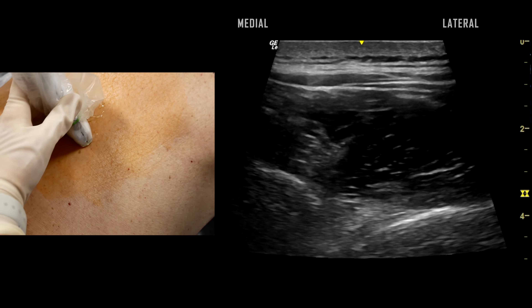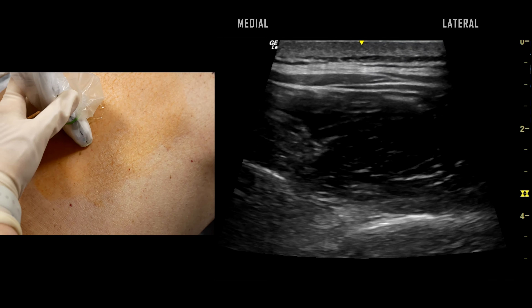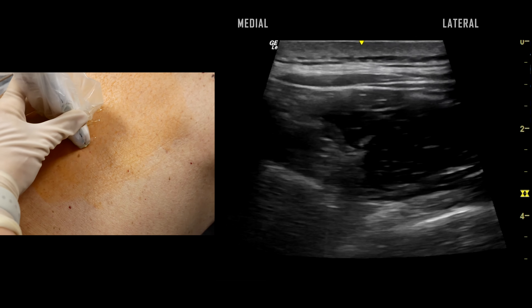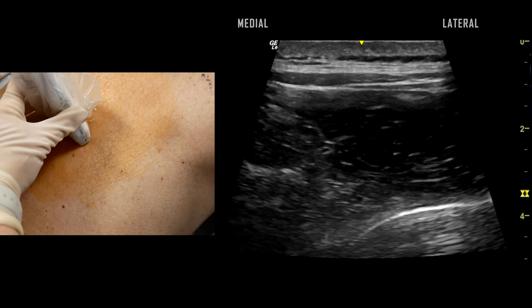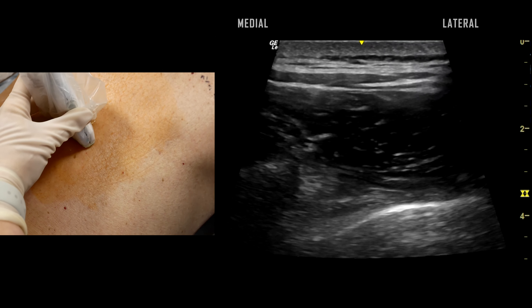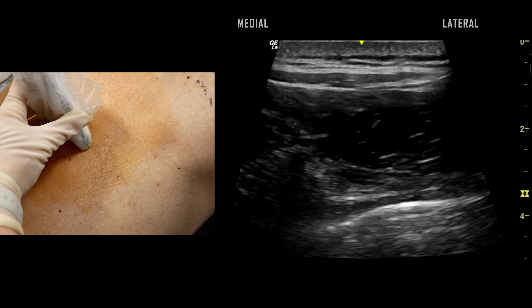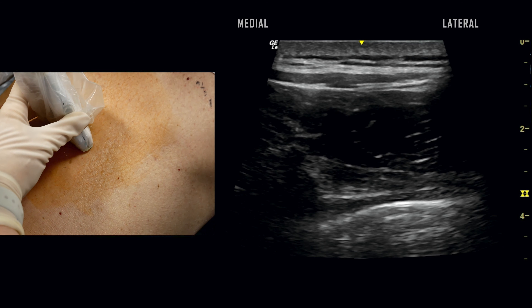Subtle manipulations of the ultrasound transducer — including translation, rotation, and tilting of the probe — may be necessary to optimize the image. The optimal view visualizes the transverse process as a hyperechoic reflection with dark acoustic shadowing at the lower left corner of the ultrasound image.